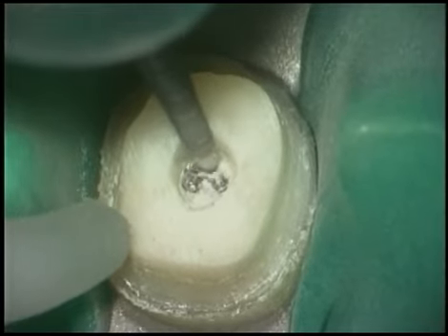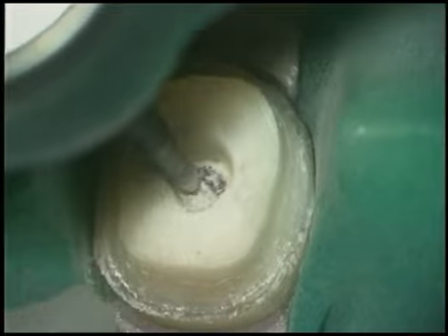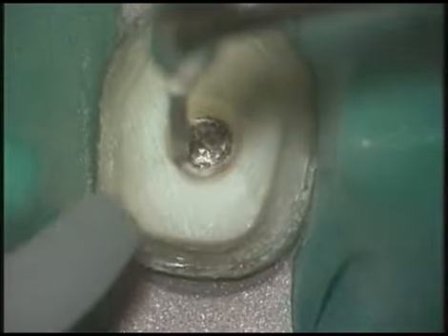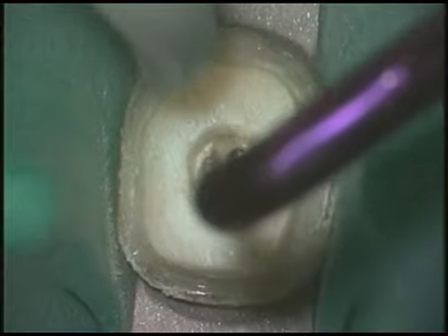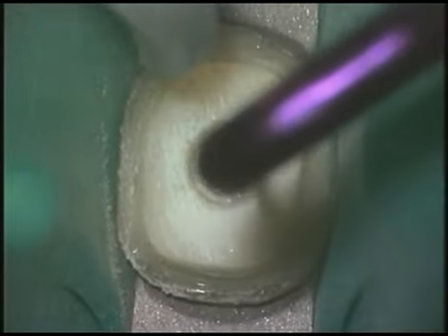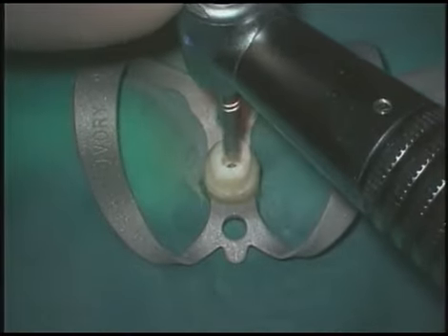Surgical length diamonds brush cut circumferentially around the post, flaring the access cavity. Here we have created a staging platform. This platform will accommodate a parallel-walled, ultrasonic small-profiled instrument. Continue trephining procedures to expose another 1 millimeter of the post.